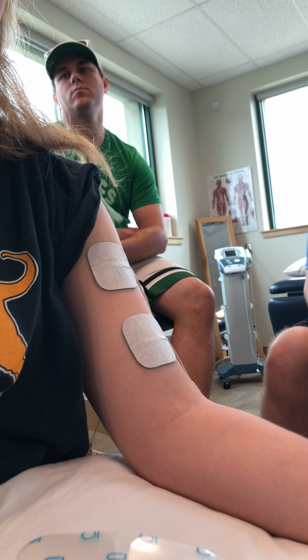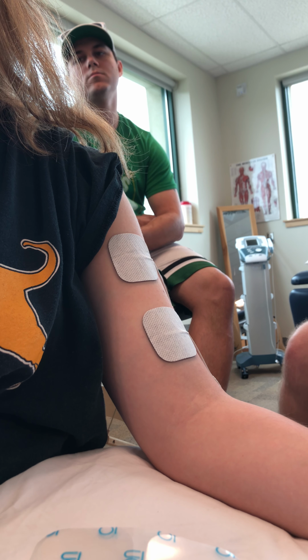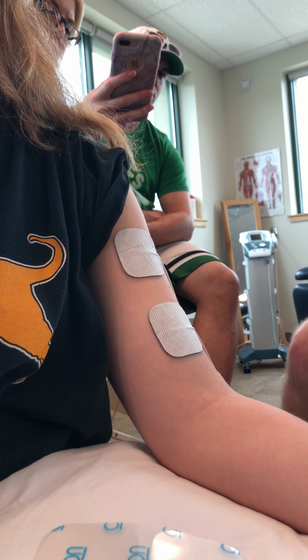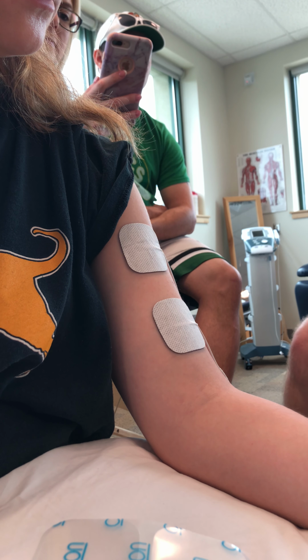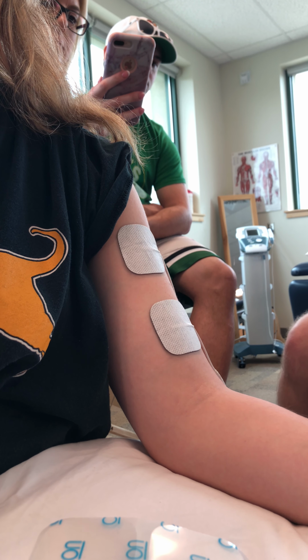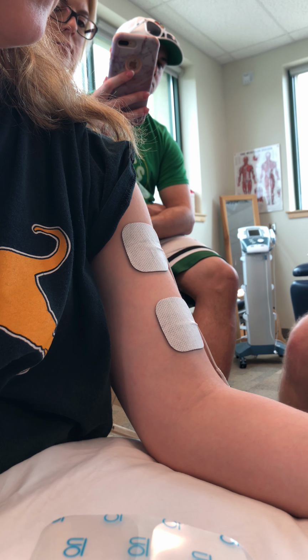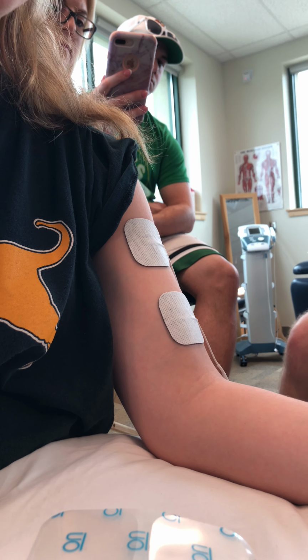All right, and again, I don't prolong the agony, so I just keep going, and you're gonna let me know what you feel, okay? I just start to feel it. Okay. That's it. Just supinate. If it's too much, you let me know. I can feel it contracting a little bit. I can see it, and I'm just gonna go until you tell me to stop. And what do you want me to feel in the end? Just a comfortable contraction. I mean, it's powerful, it'll move the whole arm up. That's comfortable.